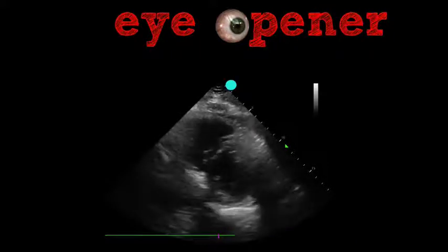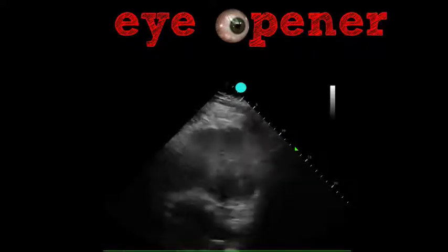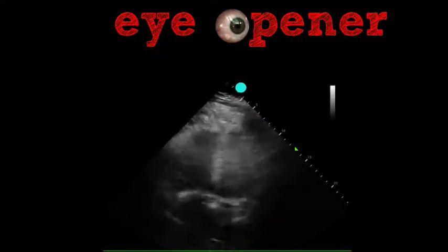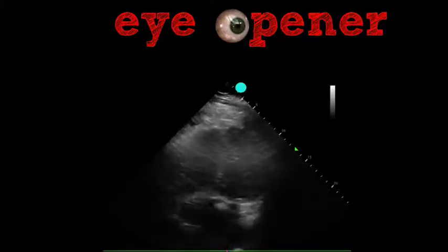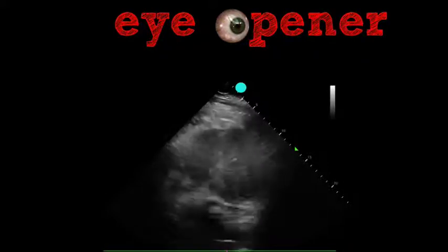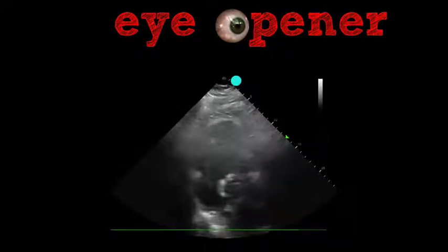So we move down to the apex, and this isn't a great view. We weren't able to roll him quite yet, but getting a quick look, we notice that the right ventricle seems to be roughly the same size probably as the left ventricle in this imperfect apical view. And then if we move the probe a little bit more towards the midline, we're able to get a nice view of that right ventricle and kind of isolate it.